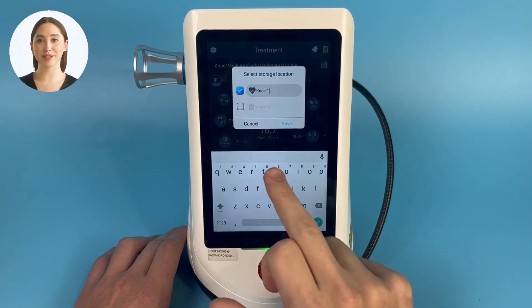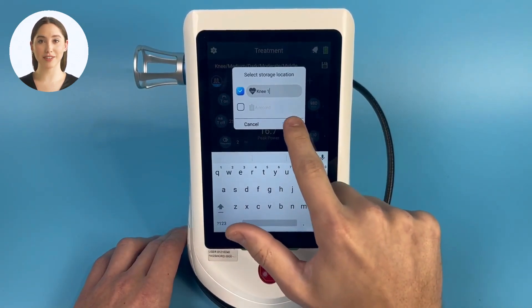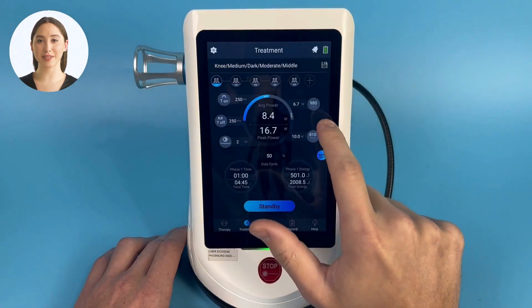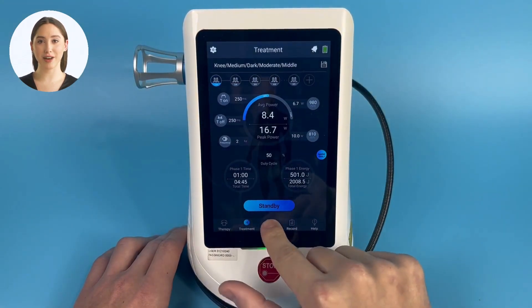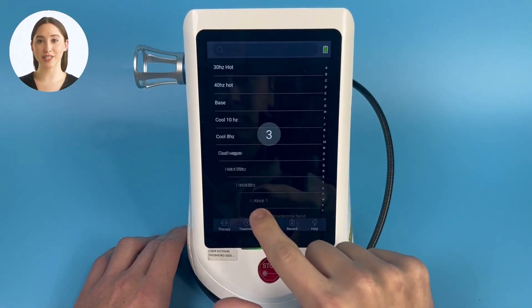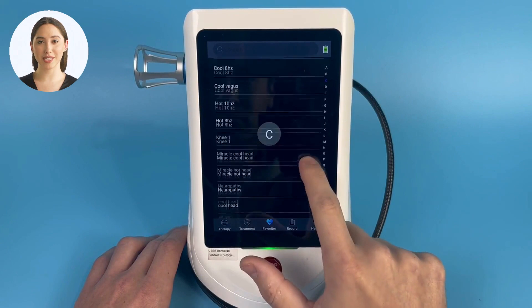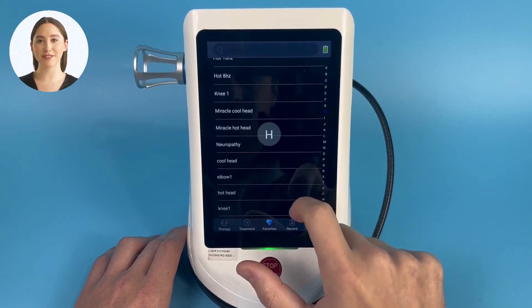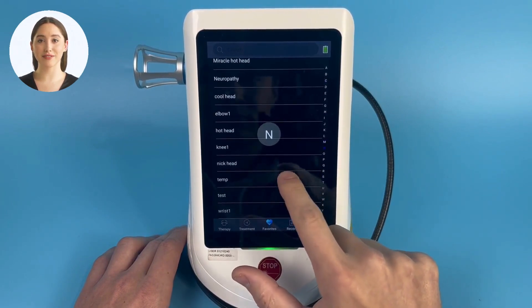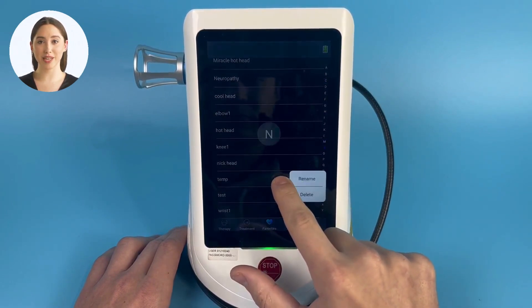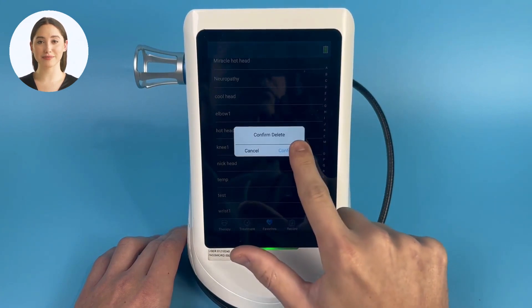Now if I wish to use this without having to edit an internal protocol every time, I can do so by starting in favorites instead of therapy and clicking 'knee one'. In order to delete or rename a favorite, hold down on the desired favorite and select the delete option if you wish and click confirm.